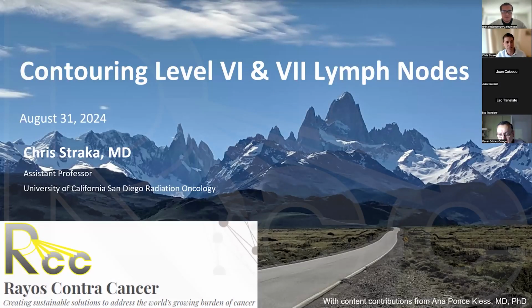Happy to be here with you all, and I'm going to talk today about levels 6 and 7 nodal contouring.